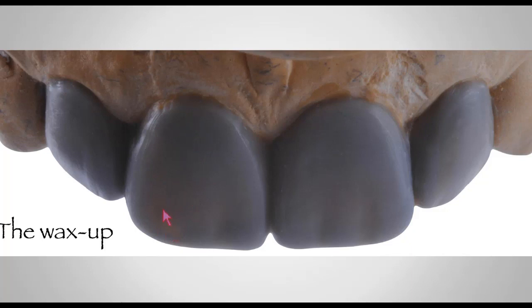This area right here is going to be an area where I'm going to need more preparation because there's more tooth structure here and there's less wax, compared to the gingival aspect of these teeth, because here there's more wax and less, you can hardly see the stone underneath the wax. You can't even see the stone underneath the wax in the gingival aspect. And the same thing happens 7 through 10 all around these teeth.